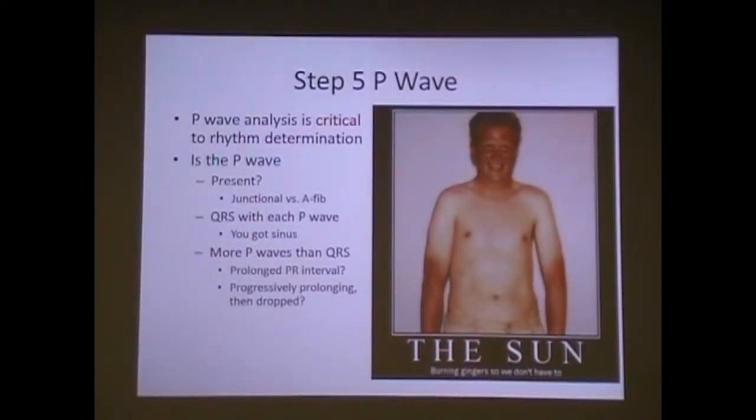Is there a prolonged PR interval? Is it progressing and then dropping? The P waves are hugely important in determining what their actual rhythm is. Morphology again, so we know that widened is left, peaked is right, inverted is coming from somewhere other than the SA node.